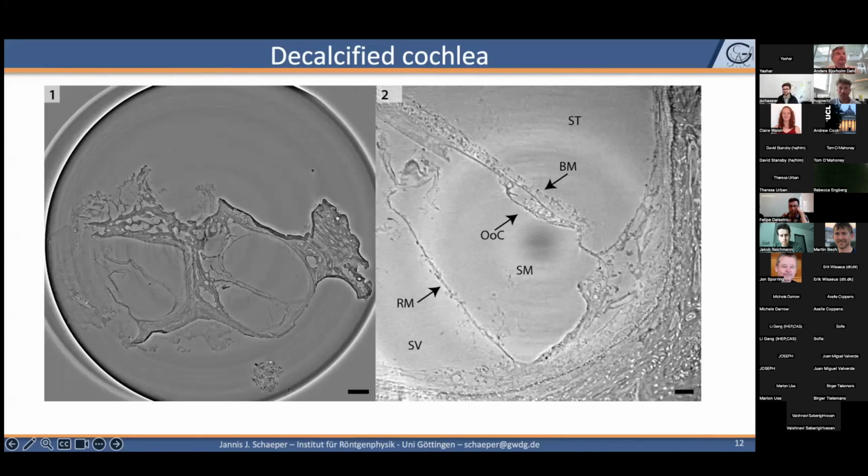Yes, I used VG Studio Max for the region growing algorithms, and for the other two renderings, which were unsegmented, the Siemens Cinematic Anatomy and NVIDIA Index frameworks.